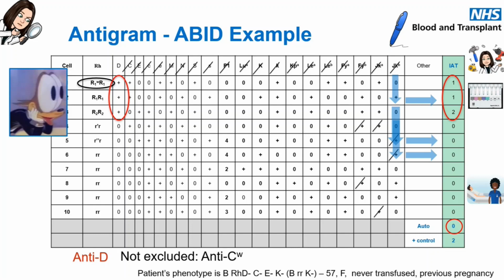Just while we're waiting for people to come in there, Helen, just a question here from Harry Gaskin. At NHSBT, are all panels done by automated method? Some are done by automated method. When I started, we used to do everything manually, but there has been an increase in work, so it tends to be for antenatal patients, with straightforward, simple antibodies. They will be done by automation, but if you've got a complex patient, it will be done manually.